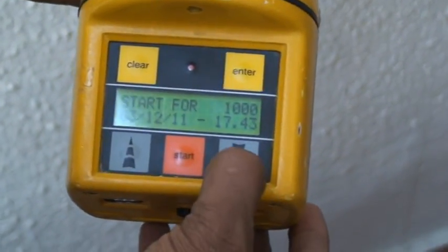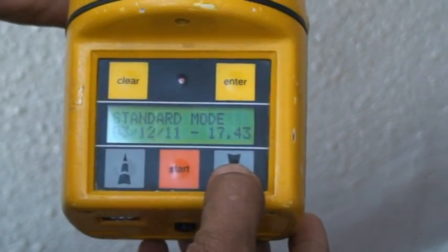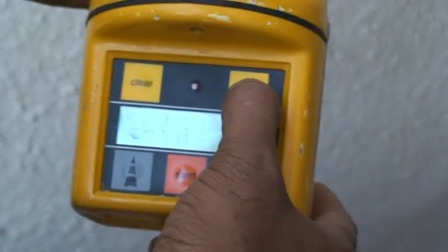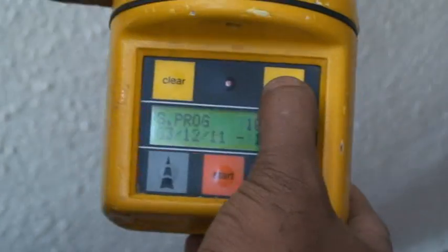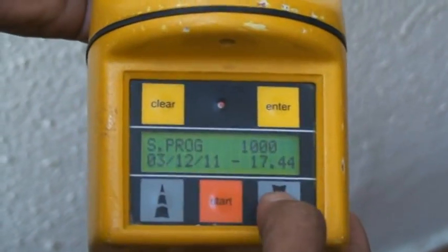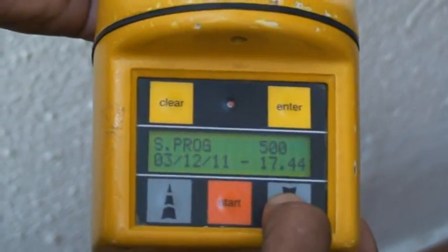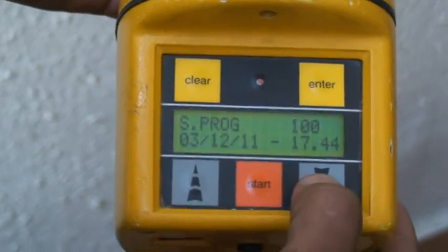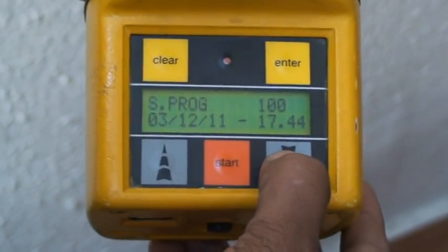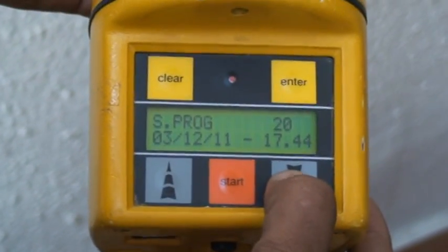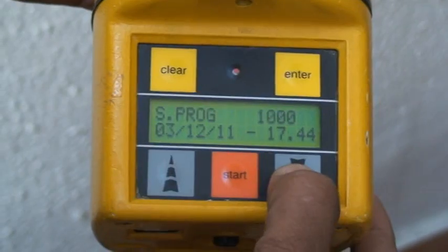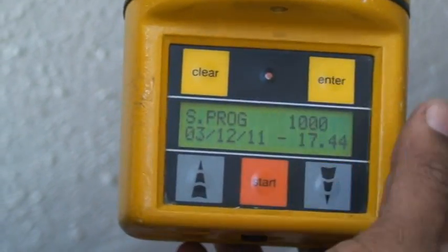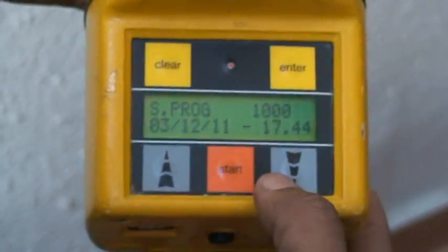You can select different modes. For example, in standard mode, when you enter it you can see the preprogrammed volumes: 1000 liters, 500 liters, 200 liters, or 100 liters. In pharmaceutical companies they normally choose 1000 liters. You choose it and just press enter — that's it.